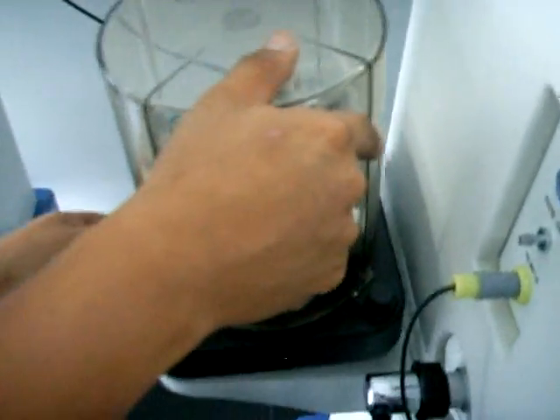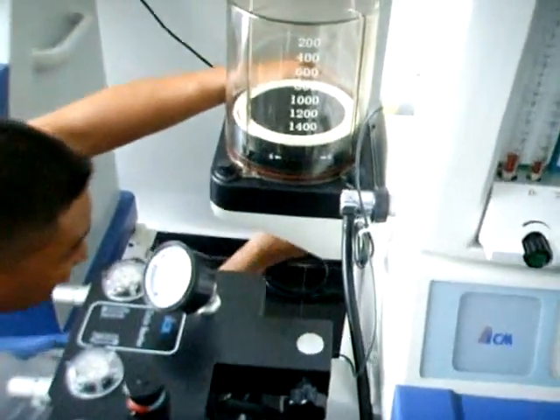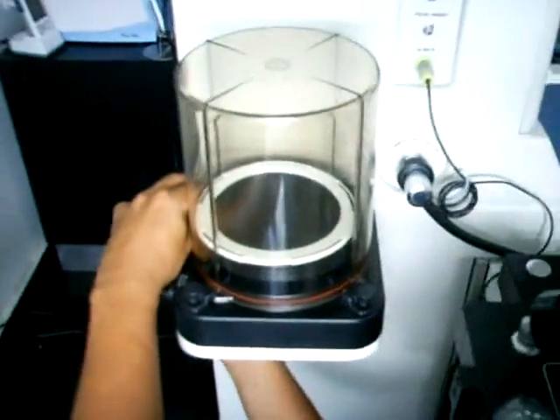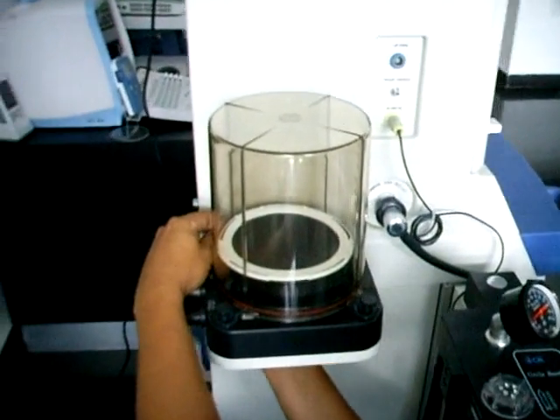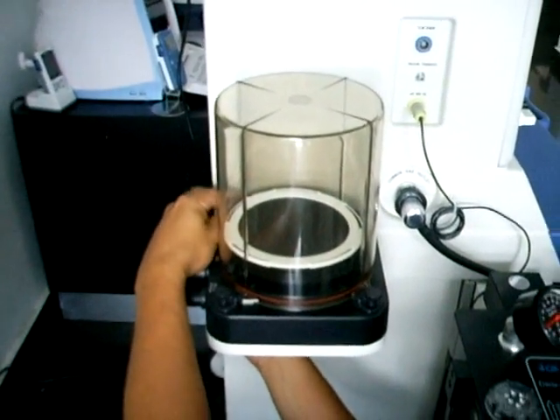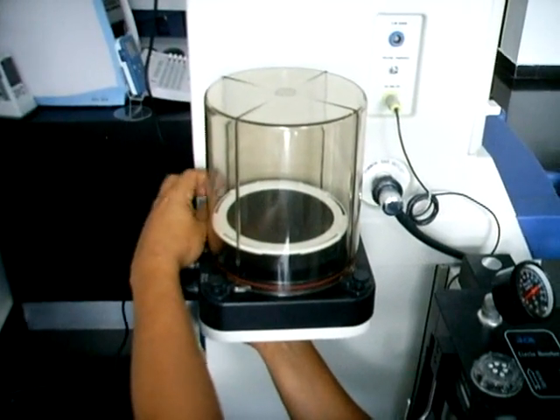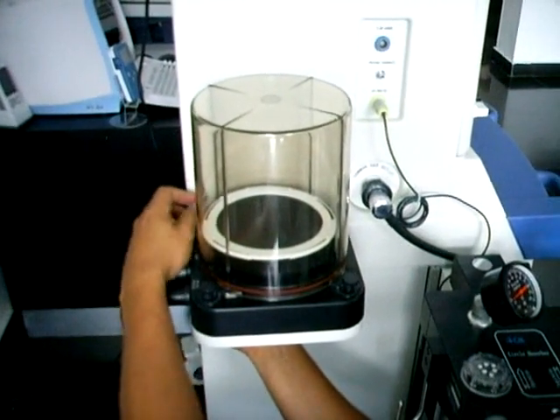Es importante aclarar que los tres tubos que serán las conexiones de las mangueras deben quedar en dirección hacia atrás. Procedemos a hacer el ajuste colocando las tuercas por la parte debajo de la base del fuelle adulto para que estos queden completamente asegurados con los pernos. Giramos levemente en la parte superior y en la parte inferior para que estos queden completamente ajustados.